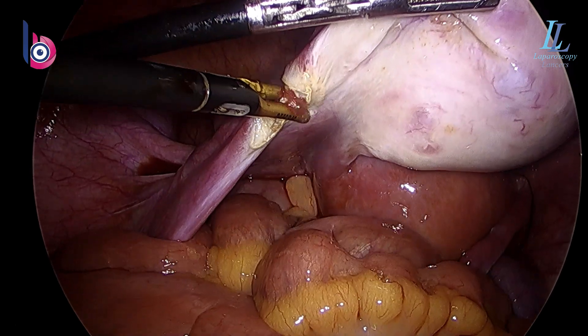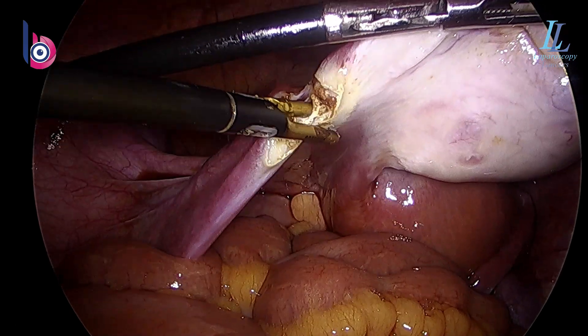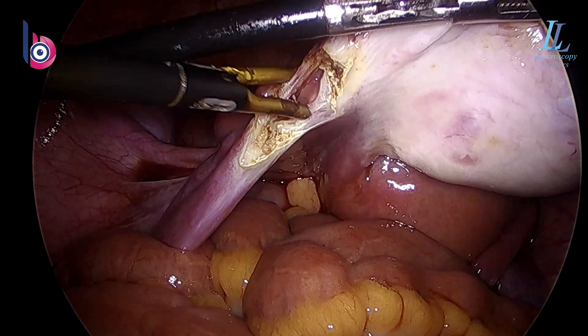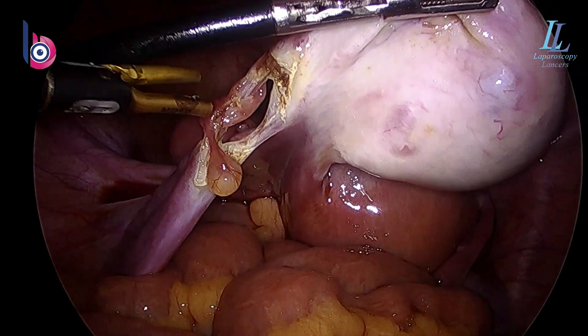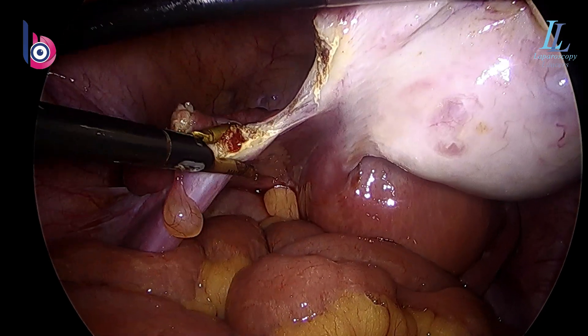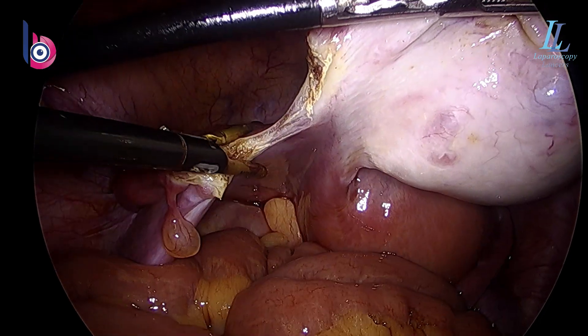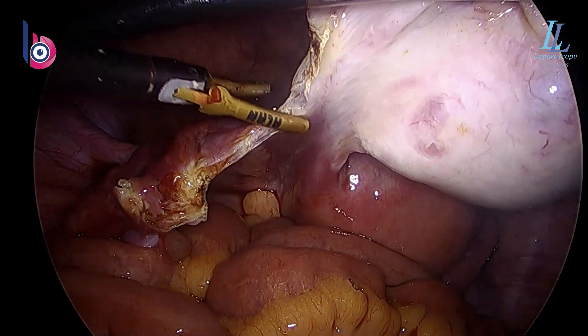The key to cutting with this bipolar shear is that it needs traction — you have to pull the tissues after coagulating. With the other two instruments I mentioned, traction is not required; they do the job by themselves. That's the IP ligament — a bit of buzz on it again to ensure hemostasis.